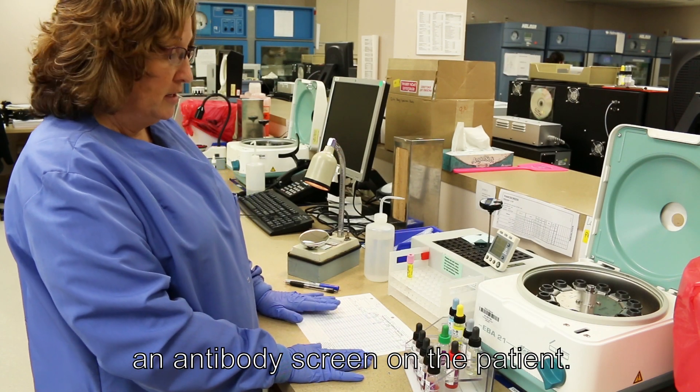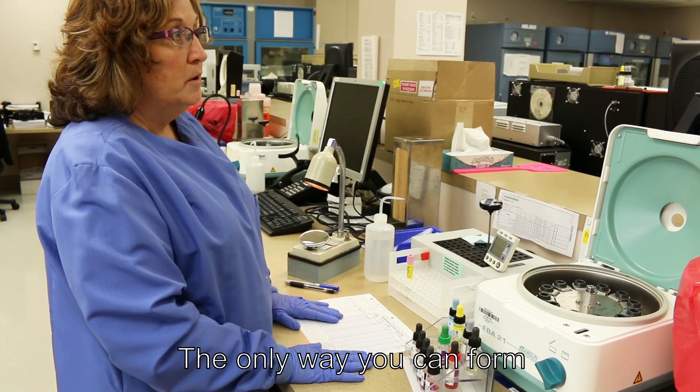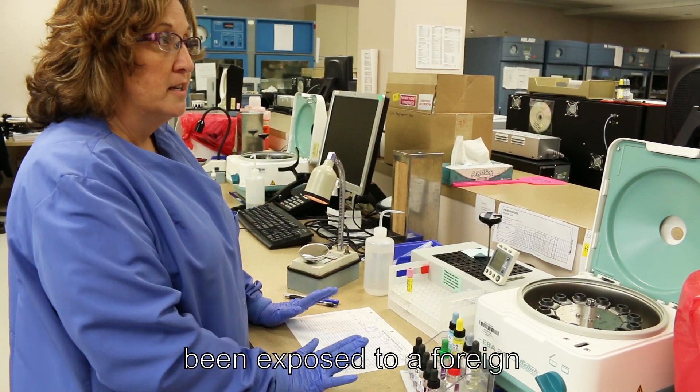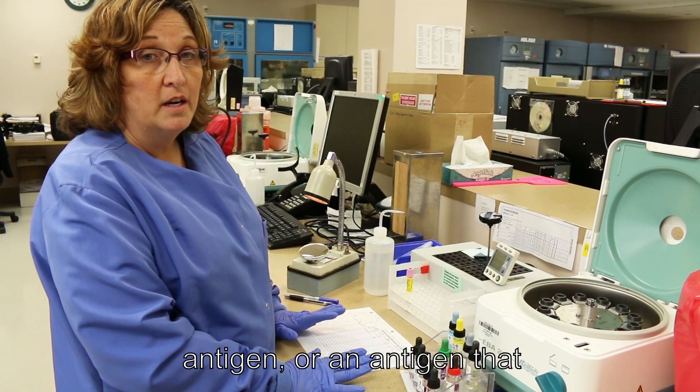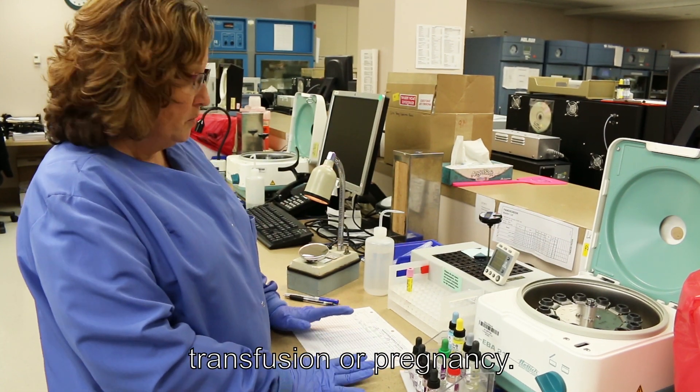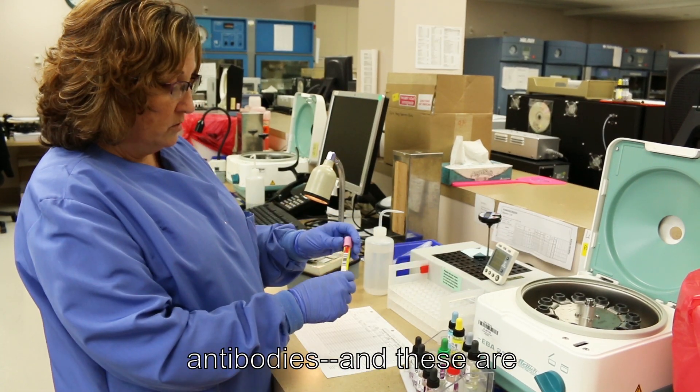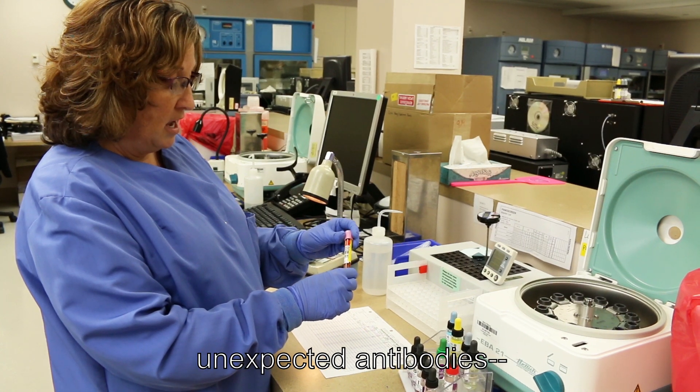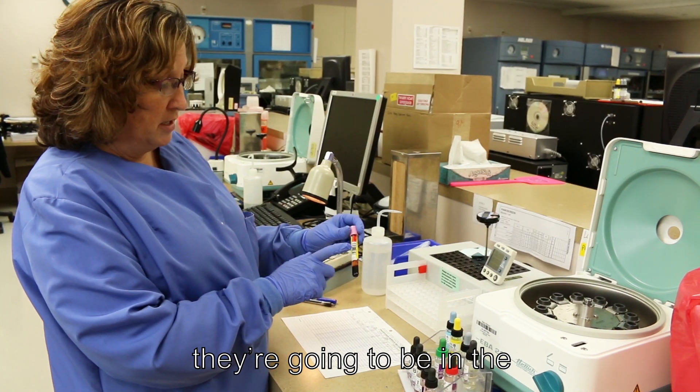All right, so now we need to do an antibody screen on the patient. The only way you can form an antibody is if you've been exposed to a foreign antigen or an antigen that you don't possess. So that would only be through transfusion or pregnancy. If the patient has those antibodies, and these are unexpected antibodies, they're going to be in the patient plasma.